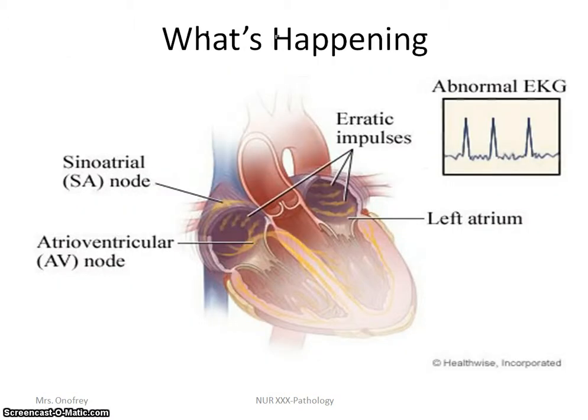In this category called atrial arrhythmias, the rhythm is generated from above the ventricles, making the QRS complex appear normal, 0.06 to 0.1 seconds. These rhythms are part of a group of rhythms called supraventricular rhythms. These rhythms are triggered by an impulse or irritable focus occurring in the atria. This means the atria are sending out erratic impulses that do not always make it to the ventricle. The atrial rhythms include premature atrial contractions, atrial fibrillation, and atrial flutter.